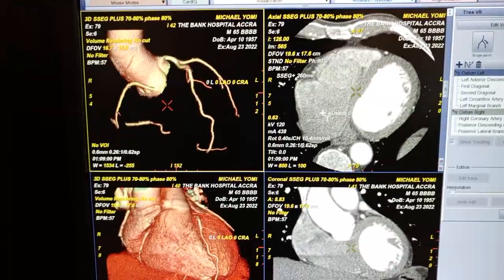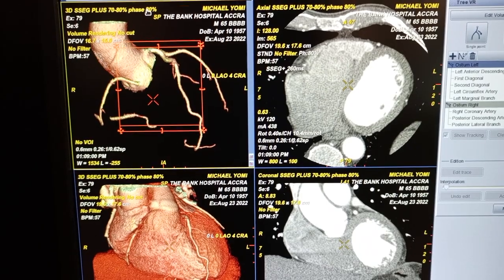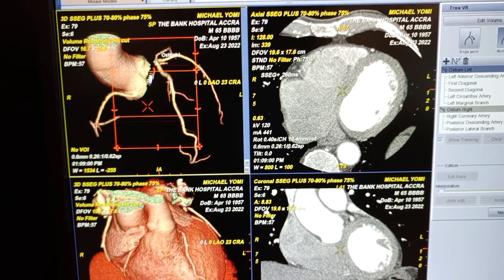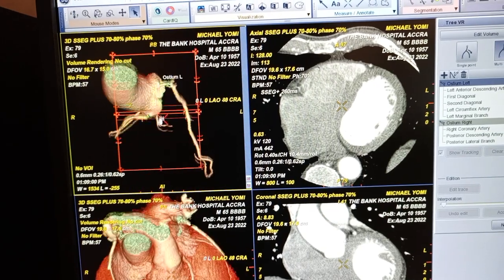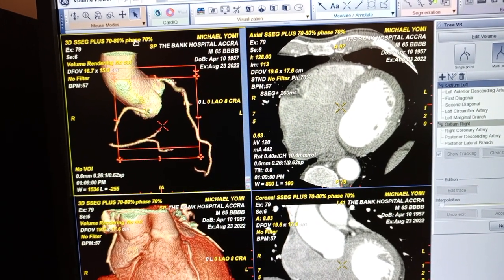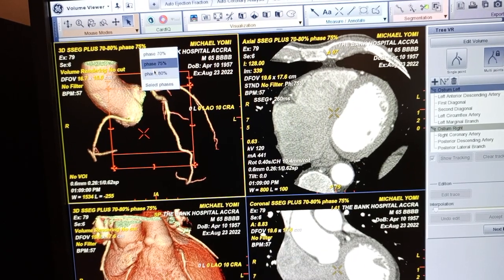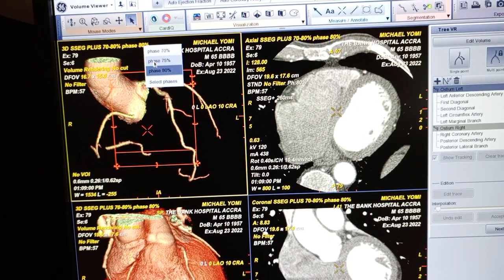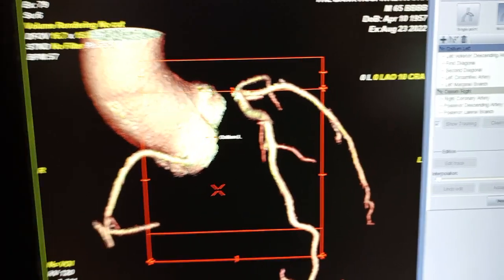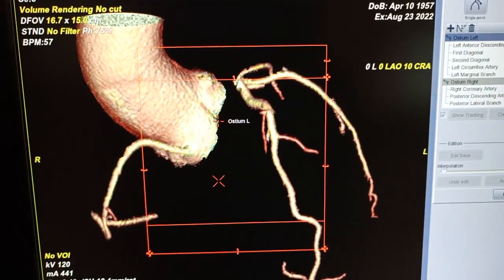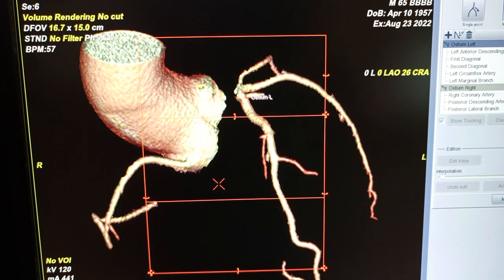It's loading and performing 3D filtering. After everything is done it gives us the images. We have the 80% phase and the 75% phase — 75 is giving us extra vessels. Let's look at 70 — 70 is giving us less. So I prefer 75 for the extra vessels. So we'll reconstruct using this, but there's a 3D required freight-train error here.